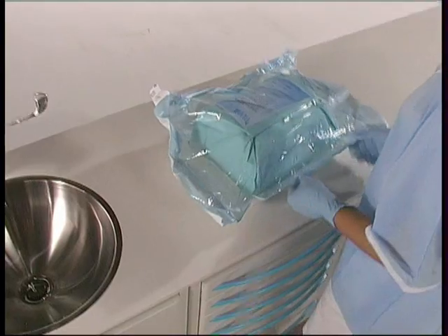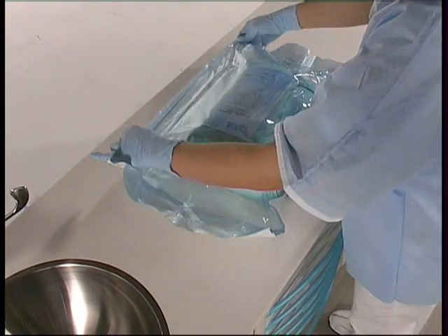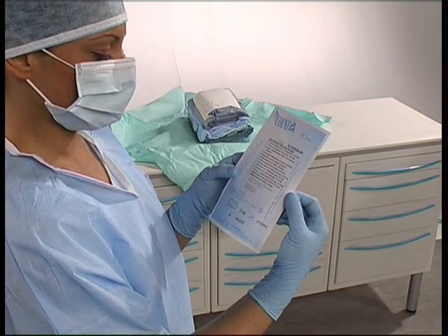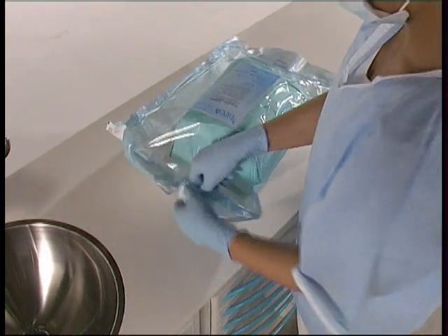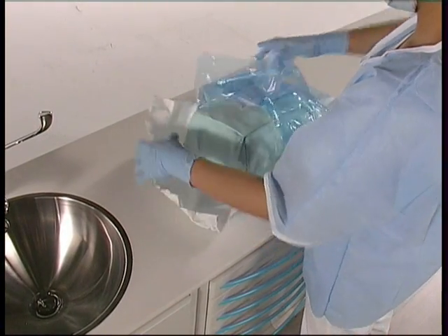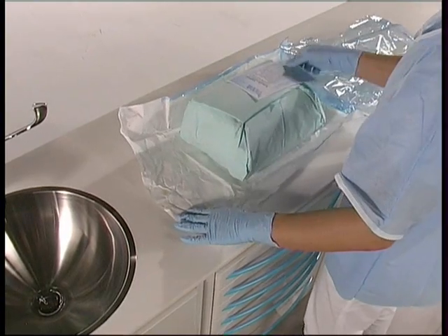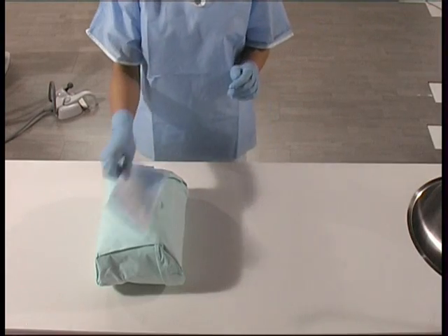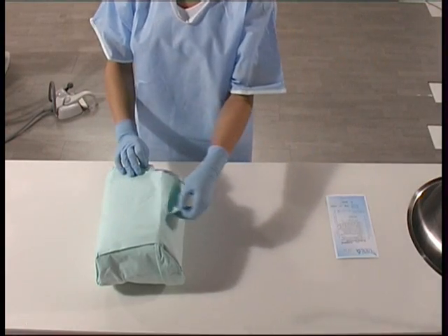Once the disinfection procedure is completed, the kit is opened. Wearing a fresh pair of gloves, the non-sterile assistant checks the kit packaging for damage. She checks the expiry date and any other warnings on the package. This information must be noted on the operation record sheet. The assistant checks that the kit contains all the necessary equipment and materials to carry out the operation. Any missing items must be added at this point. Having completed this check, the assistant removes the surgical kit from the package and uses the tabs to unfold the second wrapping.